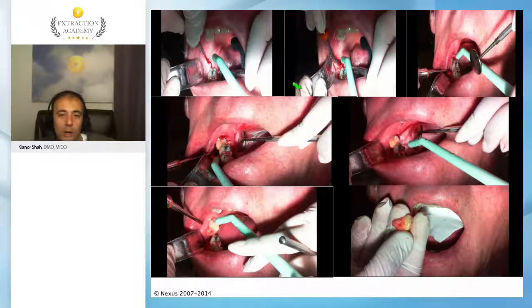We use our periosteal elevator to remove all of the tough and hard fibrous tissue that we see on top of the tooth, and start to expose slowly with the minimal damage that we can create by removing it. Expose the tooth, the coronal aspect, have good visibility, because the x-ray, especially the Panorex, is not going to be very revealing as to how you need to perform the extraction. You have to actually have clinical visibility as well. So we come in, we take a good look at our tooth, we elevate mesially and buccolingually, and slowly elevate the tooth out of the socket.